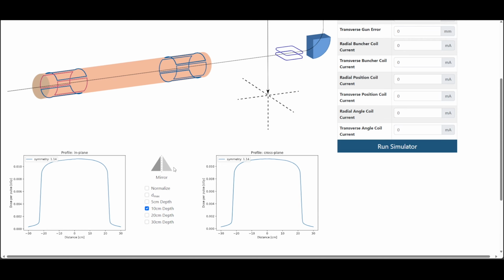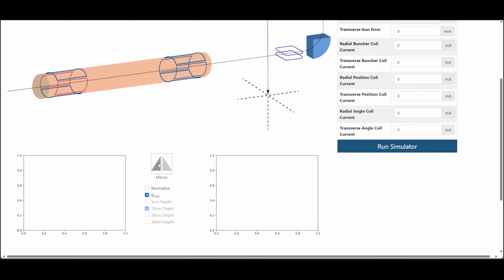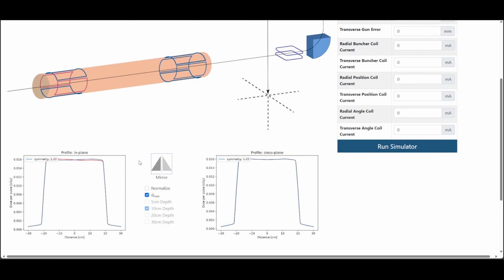We can use the mirror function to mirror both profiles along the central axis, to highlight any asymmetry in the profiles. We can manipulate the positional coil current to make the profile symmetric again. The in-plane profile is affected by the radial coils. I will introduce -25 mA current in the radial positional coil.